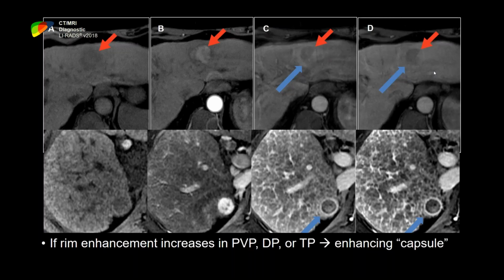You look at many other features that can help you make up your mind whether this is toward malignancy or toward benignity. Again, these features work together toward a specific category. So LI-RADS still asks you to use your mind and a proper thought process to reach a specific category. And like what Claude said, the multidisciplinary tumor board is also very important, because in some cases clinical context, other lab evidence, and tumor markers would lead to biopsy. They decide on biopsy or follow-up or other management options.